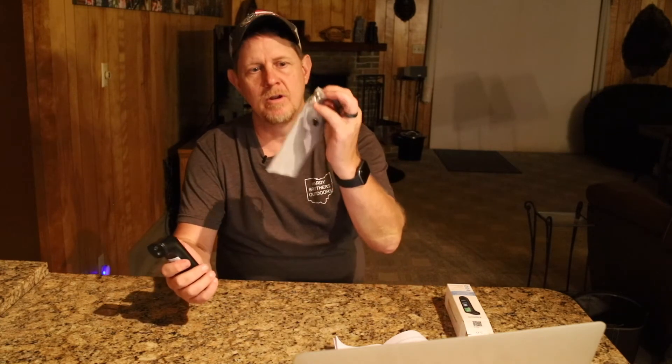The packaging comes with this little carrying case and the necessary batteries for it — I think it's two AAA batteries — and a user guide.